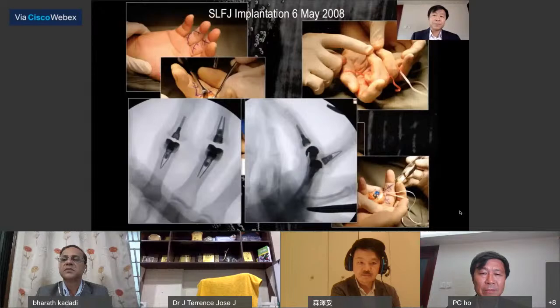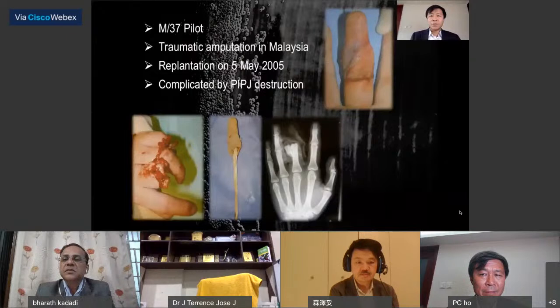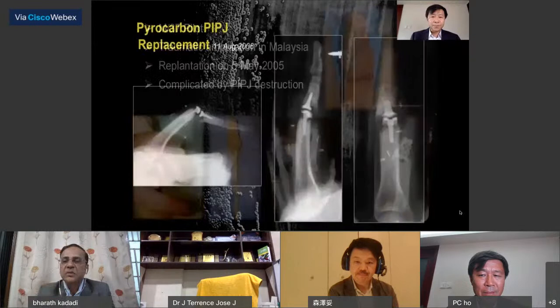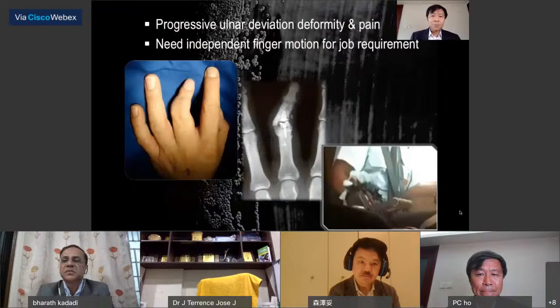Another opportunity came with a 37-year-old male pilot. He suffered a traumatic amputation in Malaysia when he was doing a relay competition there. Fortunately, the Malaysian colleagues did a very beautiful replantation and saved his middle finger. But that was complicated by slow PIPJ destruction, presumably due to some local infection. They were brave enough to replace the PIPJ with a pyrocarbon implant and obtained a nice outcome at the beginning. But as you see, this is also common with the pyrocarbon implant, which tends to be undersized, and in this case it led to recurrent instability, progressive ulnar deviation deformity, and pain.